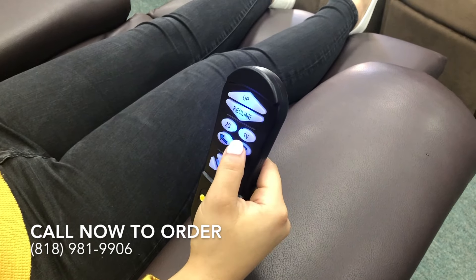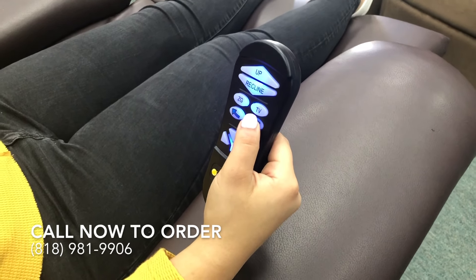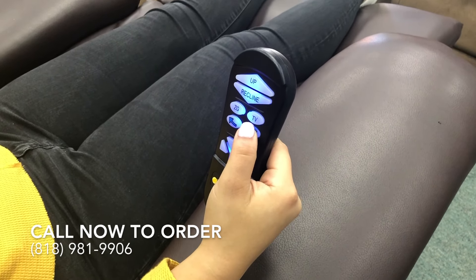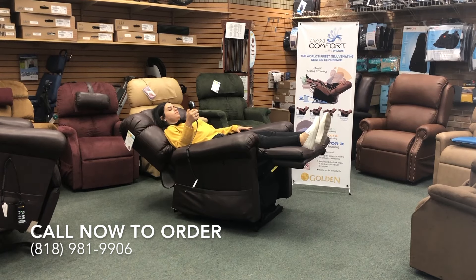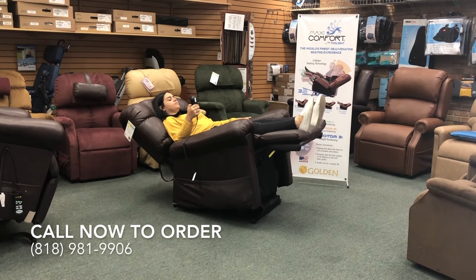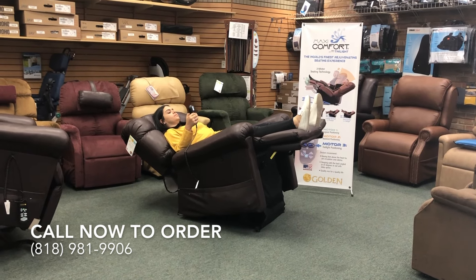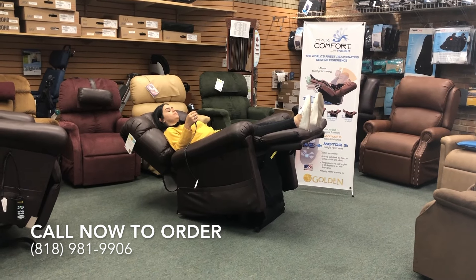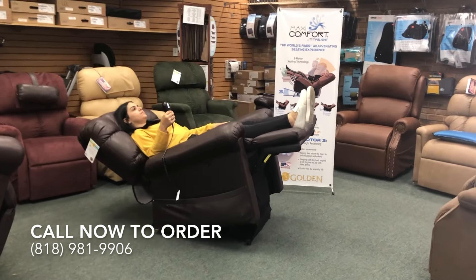We will now move on to twilight positioning by pressing the right side arrow on your control. As you can see, the chair is being elevated four inches only in the front. This puts the patient in a cradle and is great for people with severe swelling or circulatory issues looking to elevate their legs.